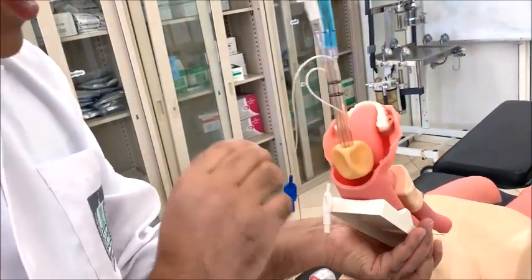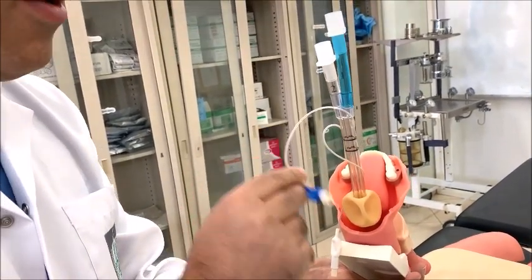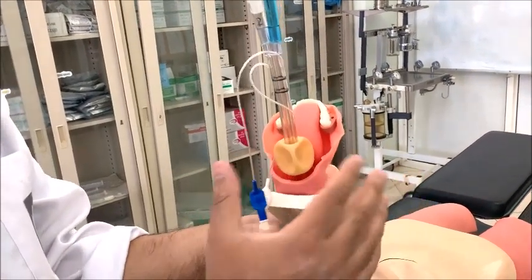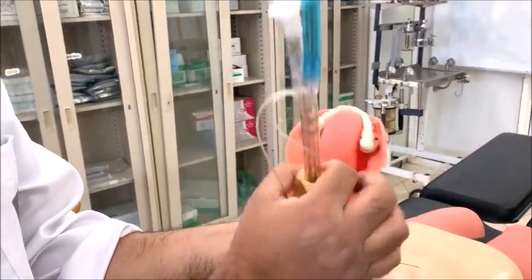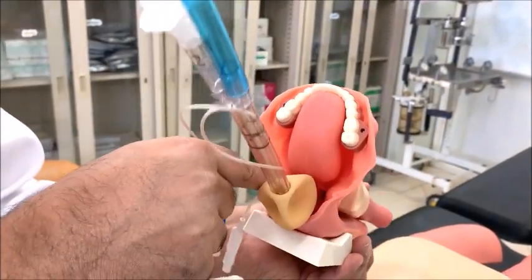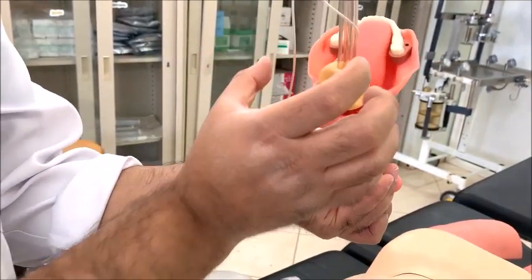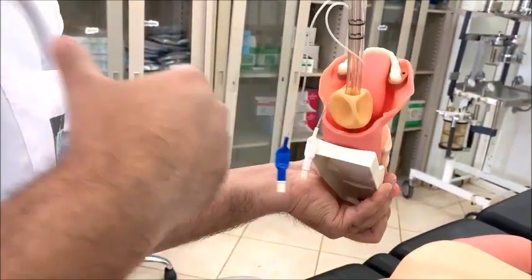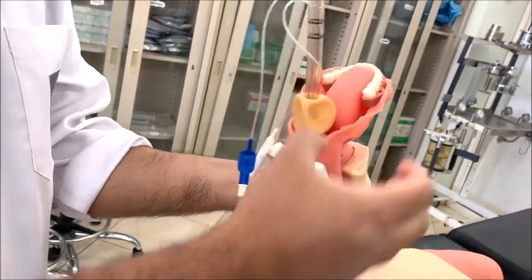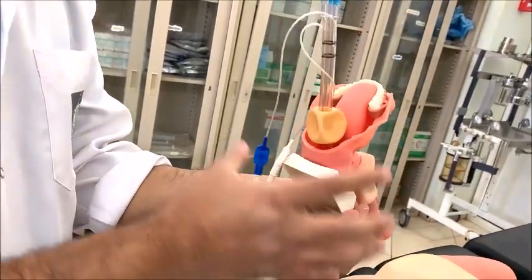After insertion, inflate both cuffs. First, inflate the proximal cuff with 100 ml of air — this will make a seal between the root of the tongue and the soft palate, so there will be no air leak. Second, the distal cuff will make a seal either in the esophagus or in the trachea.